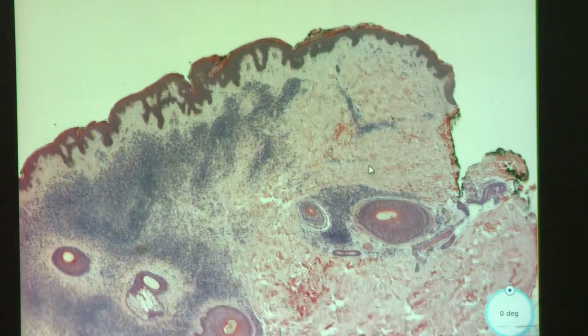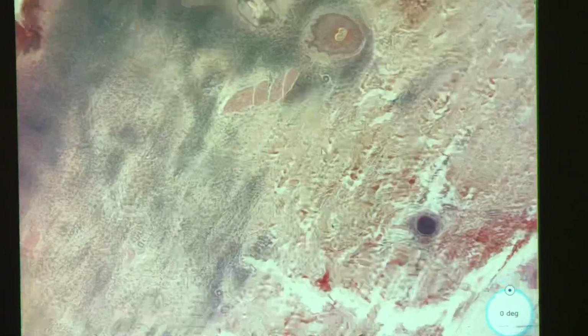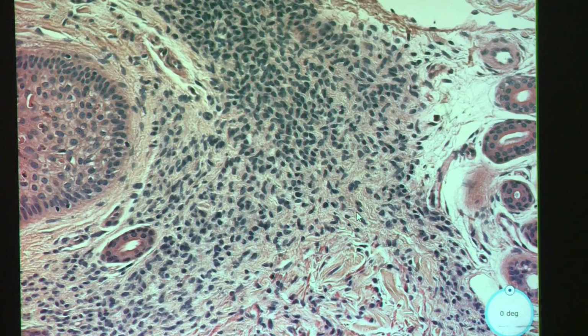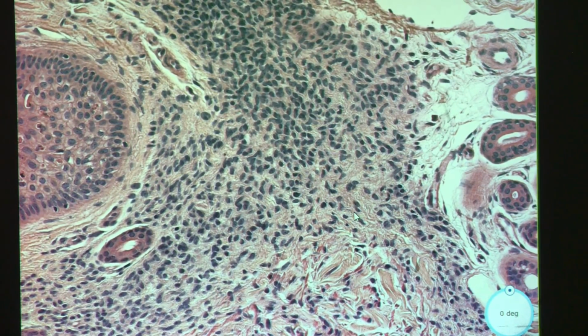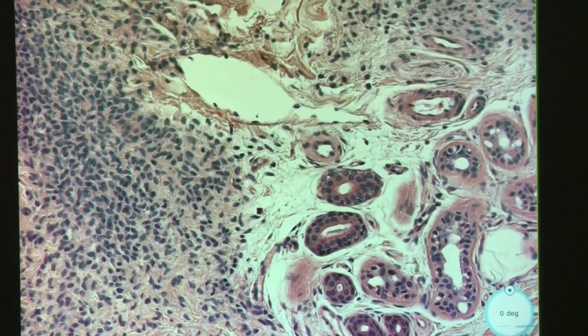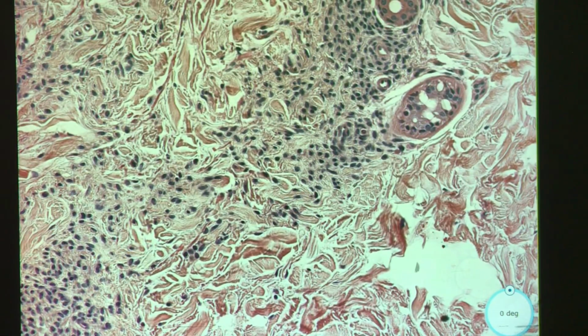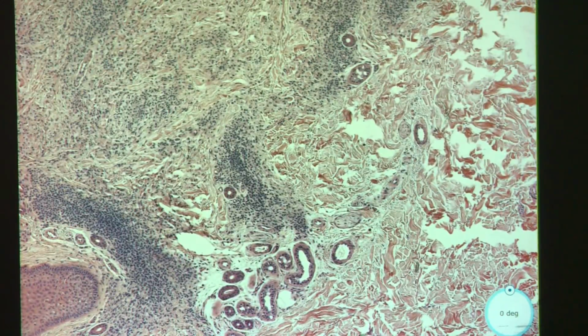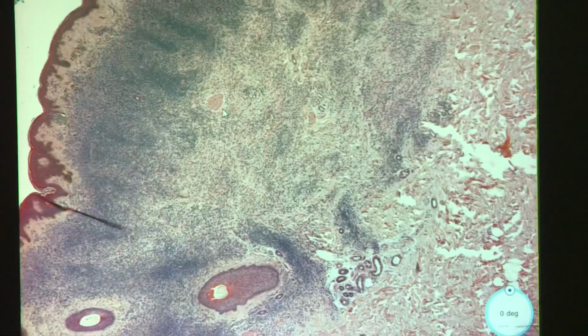Okay, anything else that we can talk about on this? The rest of the dermis is relatively bland. Again, these are more melanocytes coming down. But you really shouldn't see atypia in them. You may or may not see mitotic activity, but it generally should look relatively the same. Even if some look more epithelioid or some look more round, they should generally be within the same family. You shouldn't have cells that look really atypical and cells that don't. So this is just a congenital nevus.